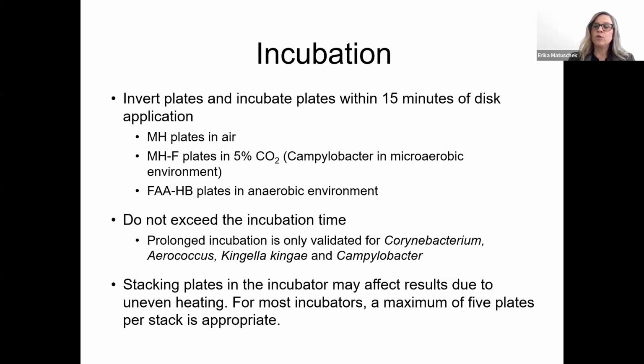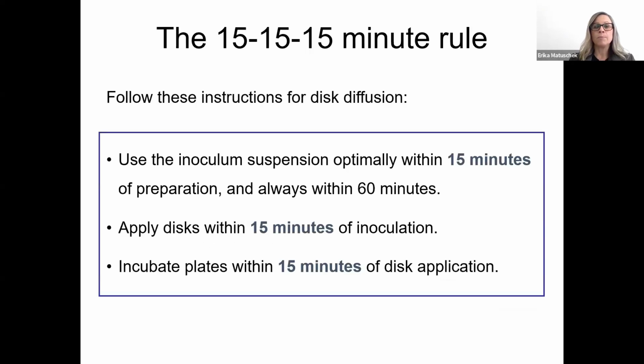When you put the plates into the incubator, it's also good not to have too high stacks. The reason for that is that you would like the plates to reach 35 degrees quite simultaneously. And if you have very high stacks, it will take longer for the plates in the middle of the stack. We don't have an absolute number here, but we know that for most incubators, a maximum of 5 plates per stack is appropriate.